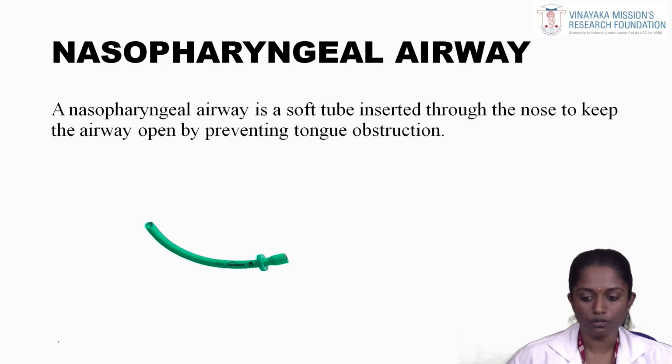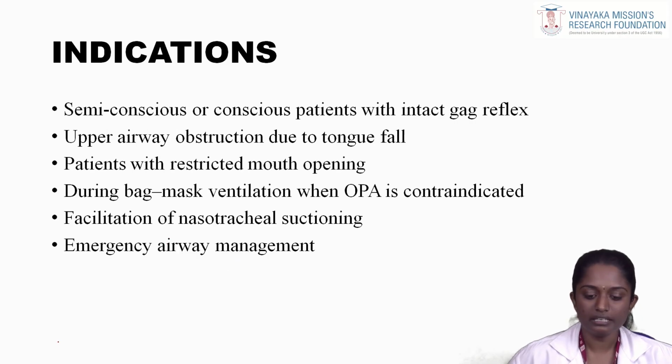Nasopharyngeal airway is a soft tube inserted through the nose to keep the airway open by preventing tongue obstruction. It is inserted into the nose, as the word nasopharyngeal tells. Now we will see about indications. First indication is a semi-conscious or conscious patient with intact gag reflex. Then upper airway obstruction due to tongue fall.